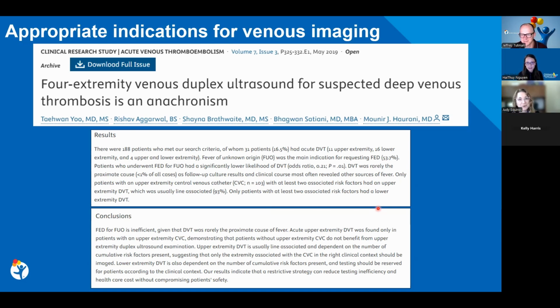Again, I'm giving you more work to do. Sorry. But if you can show that the pretest probability and post-test probability is not high enough in these patients to warrant it. Sometimes the clinicians just don't realize it takes an hour to do, sometimes longer, depending on whether it's a patient with a complex medical history and they have contractions or whatever the case may be.